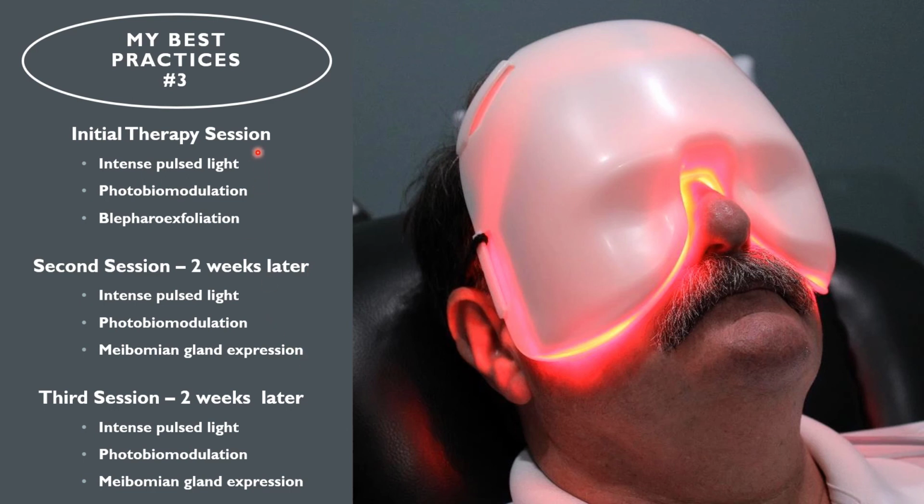See, so now you've given them 2 weeks to let that congealed meibum soften up, loosen up. You're getting them ready to do this. Now you do all of this stuff. This is a lot, man. They're in the office an hour. I mean, this don't take but 5-6 minutes, 15 minutes here. But you or your staff or somebody has got to squeeze those glands. That's a lot of work. But, again, extremely effective.